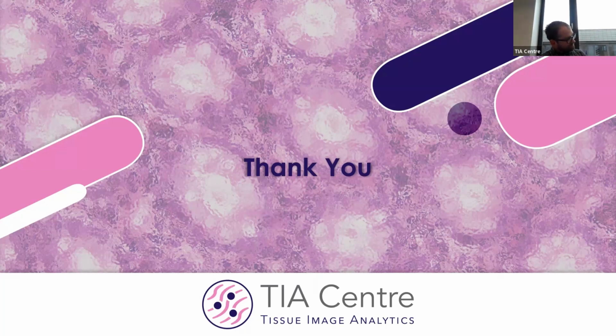There are some potential disadvantages in that using Bokeh, you're limited to the Bokeh tile source viewer, which at the moment, for example, doesn't support some types of tiles, which would potentially allow you to speed up the visualization. It may be possible that those get added to Bokeh in the future, but there are some performance-based limitations to Bokeh.